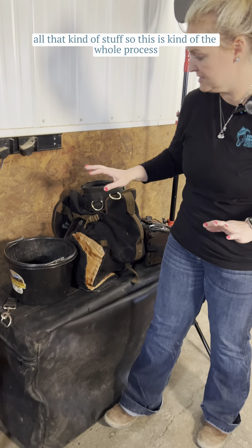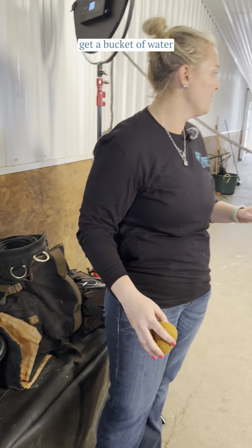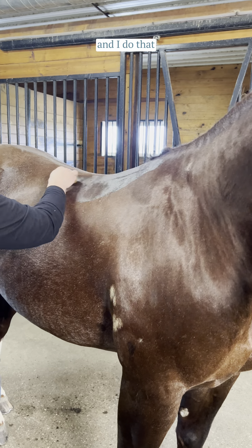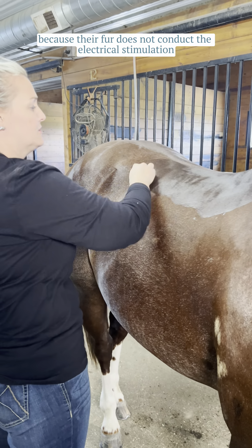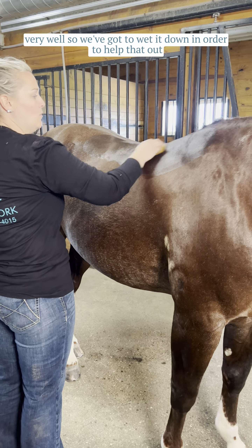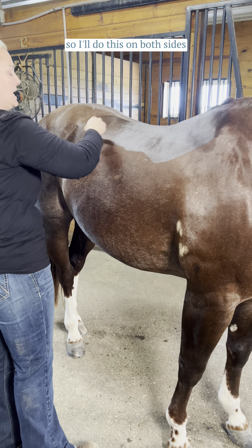So this is kind of the whole process. When I start, I always have a bucket of water, and I'm going to wet the skin where I'm going to be putting the pad on them. I do that because their fur does not conduct the electrical stimulation very well, so we've got to wet it down in order to help that out. I'll do this on both sides.